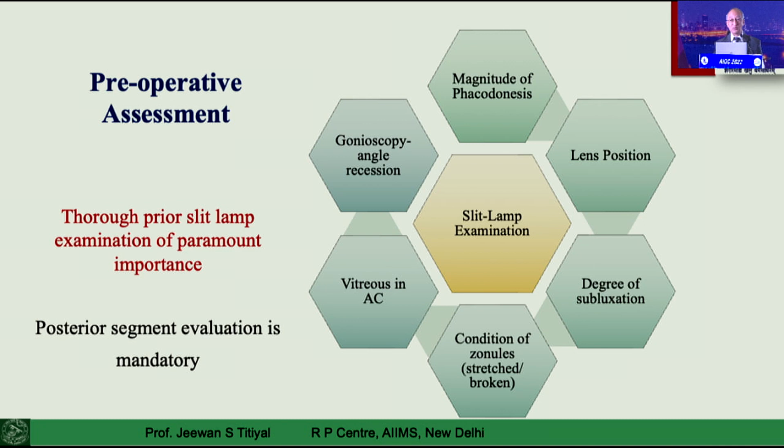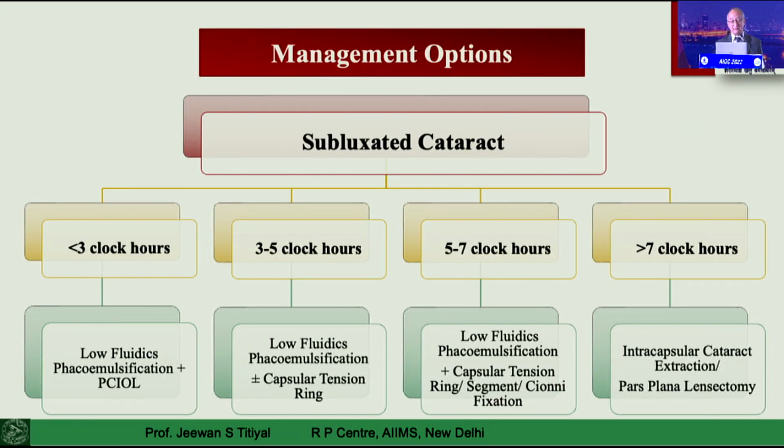Apart from that, posterior segment assessment is very important in all cases of subluxation, because you may have a central macular pathology. There may be a macular hole. The visual analysis has to be done before surgery and proper counseling has to be done.